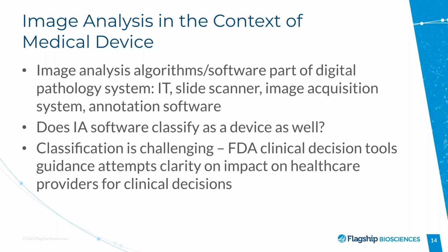So the things to keep in mind is that one has to use the guiding principle of QC when dealing with this assay, and has to have a very rigorous process of validation of the assay. And there is a little bit of a paradox: it keeps the pathologist interpretation as the gold standard, but is also very well aware that in some cases this assay may be dealing with a pathologist-impossible endpoint, and therefore by definition one cannot use pathology as the guiding light.